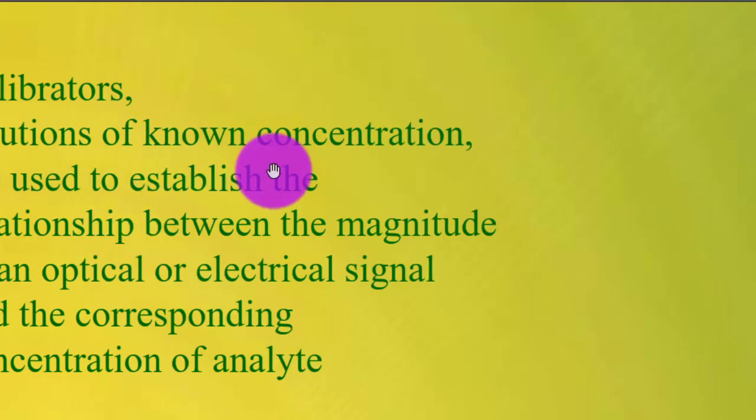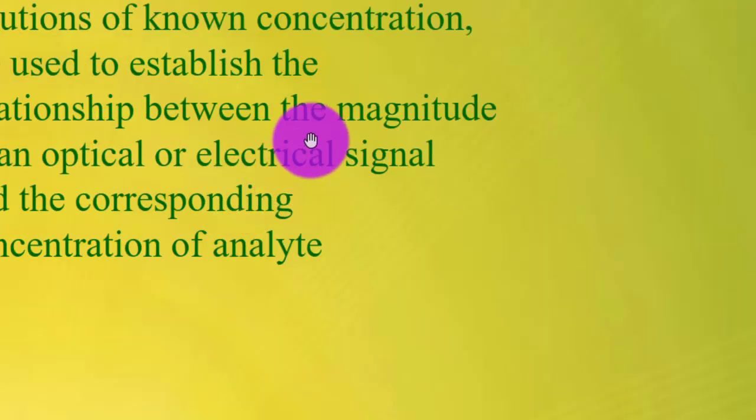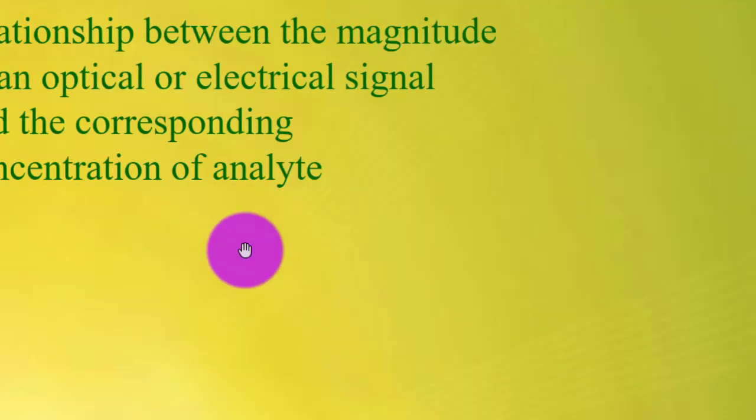Calibrator solutions of known concentration are used to establish the relationship between the magnitude of an optical or electrical signal and the corresponding concentration of analyte.